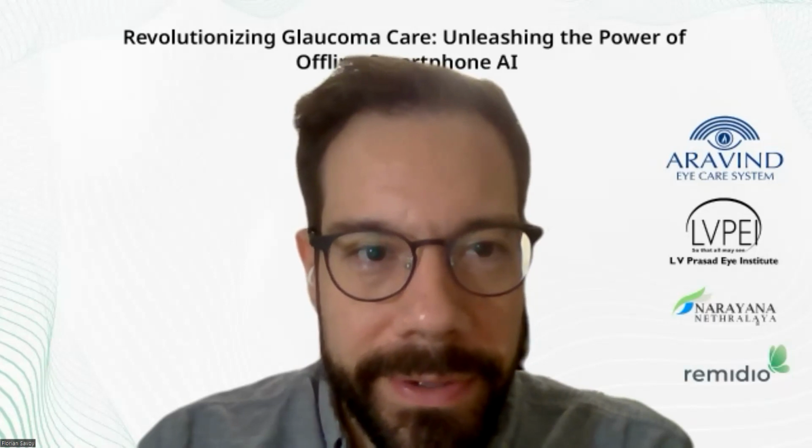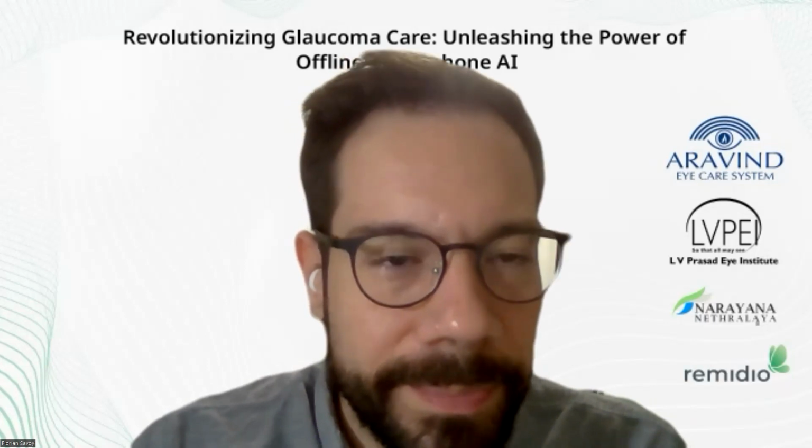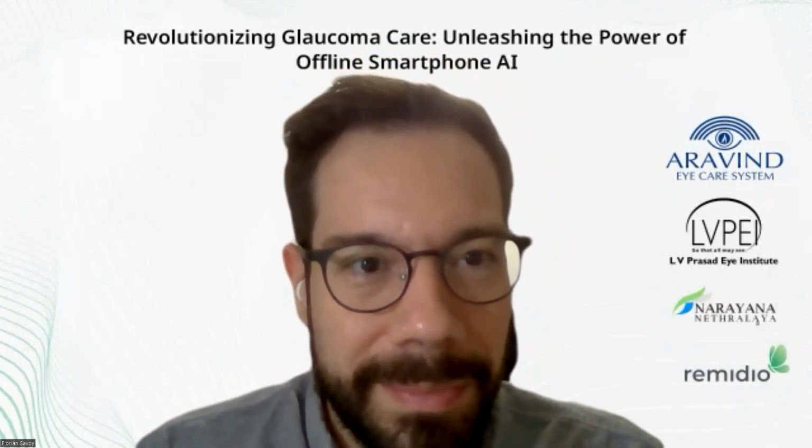That's right. My next question is to Florin. Florin, how is patient data protected with this AI system? I think the fact that we deploy the AI offline on the device means there's no communication to an external server. So the images remain on the device. And you can have an assessment without an internet connection, which means the privacy of the patient is guaranteed. We also have within the Remidio device some options for cloud backup within Remidio Connect. Those have passed all the data privacy standards, HIPAA and GDPR and so on. But the AI itself runs offline, which means there are no privacy concerns here because the images stay on the phone.